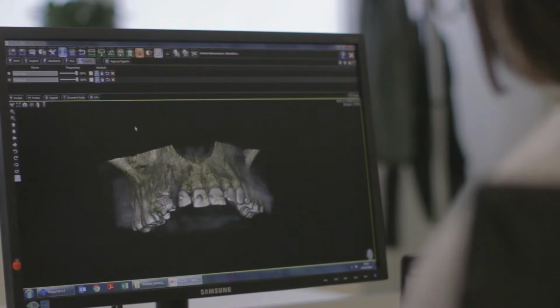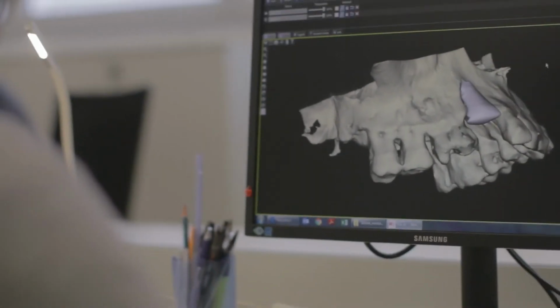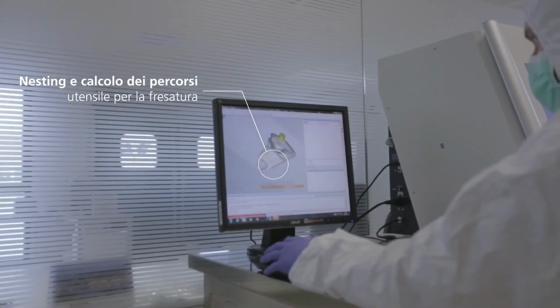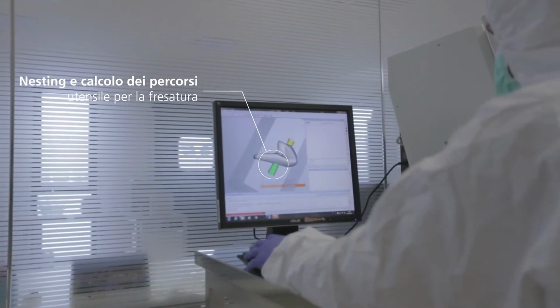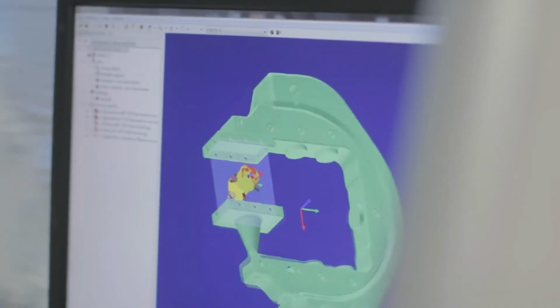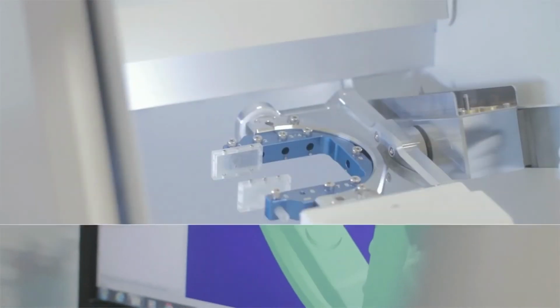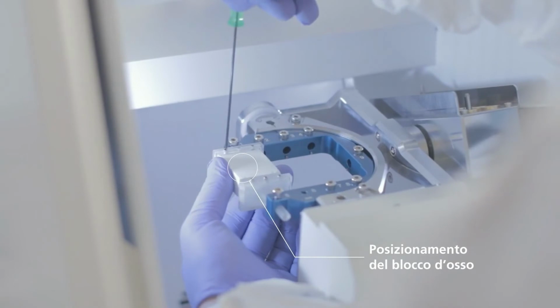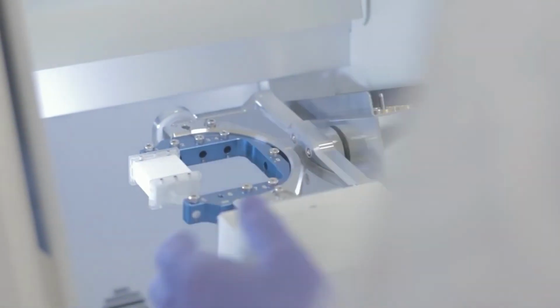The company has a very valid service. In this service, basically the engineer and the biologist design the scaffold using different software, and then they prepare the scaffold for milling, and they mill the scaffold in a controlled way, in a controlled environment, in a white chamber, using a milling unit like this milling unit by Roland, the DWX-52, and everything is of course controlled, and we can obtain the scaffold.